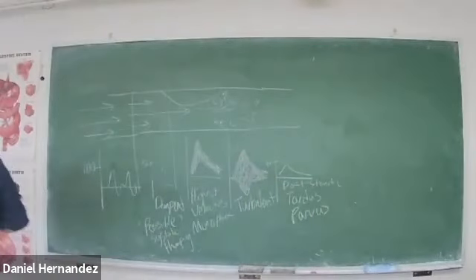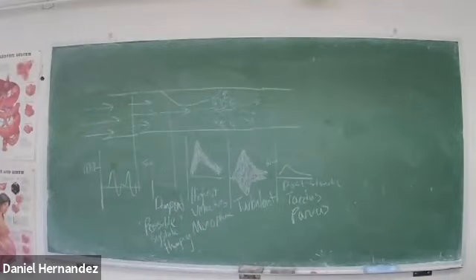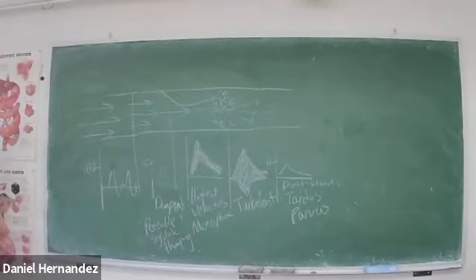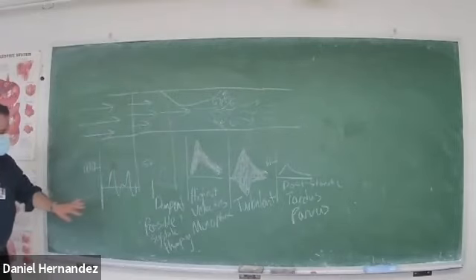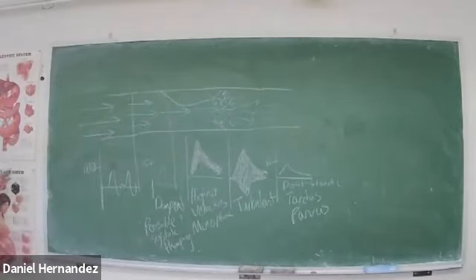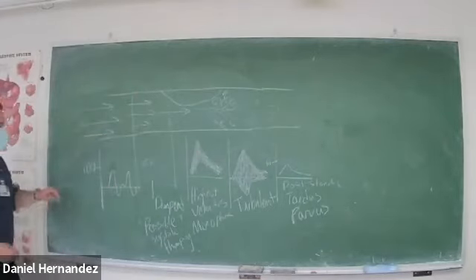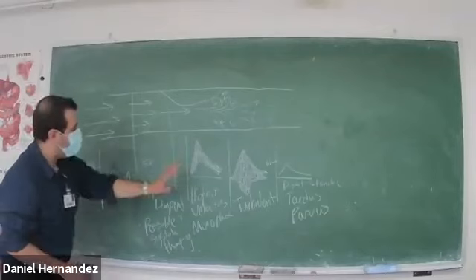So I just wanted to make sure everyone's kind of familiar with some of the waveform changes that happen within arteries as we're approaching a stenosis or a blockage. So typically in arteries, we have a nice laminar flow. Fast velocities are going to be in the center of that vessel. Nice healthy artery, we have a nice triphasic waveform. But as we start approaching a blockage or a stenosis, we start having some changes to our waveform.